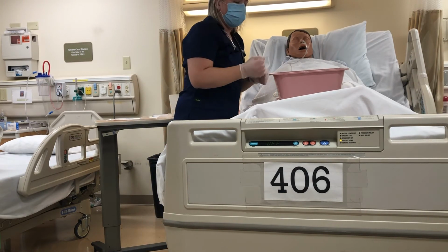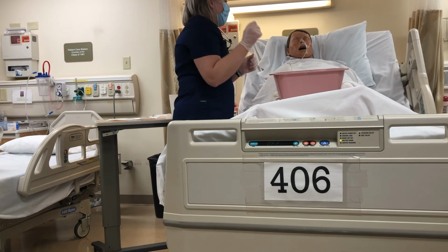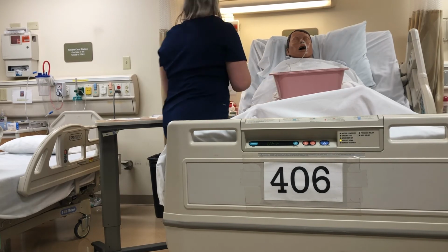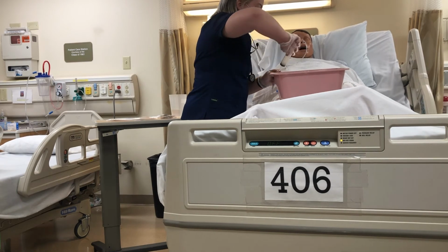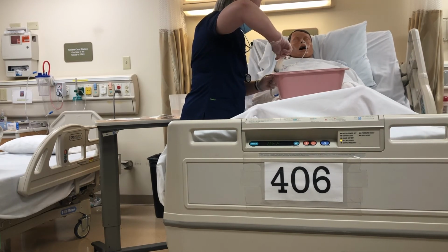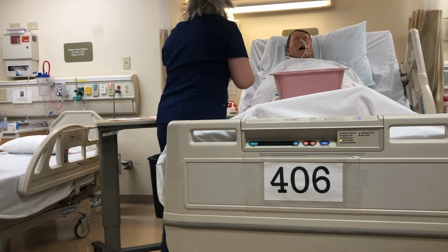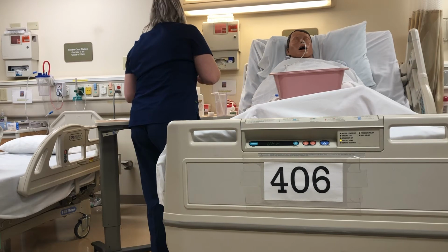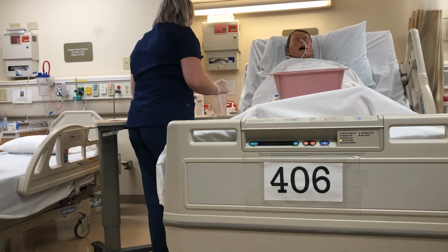Alrighty. So to make sure that I have the tube in placement, I am going to do 2 checks. The first thing I'm going to do is pull a little bit of that content out of your stomach, and we are going to test the pH of it, just to make sure that the pH is acidic. That would indicate that it is in fact in the stomach. So I'm going to put this little test strip in.